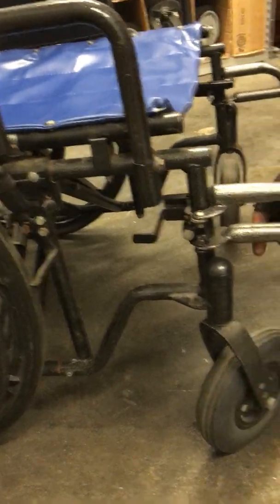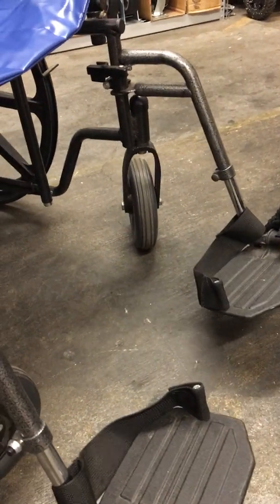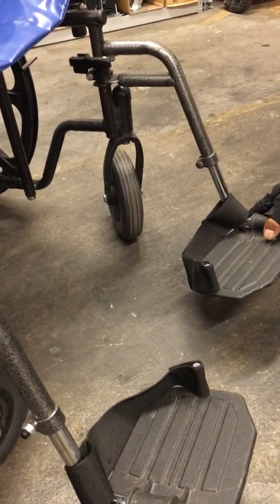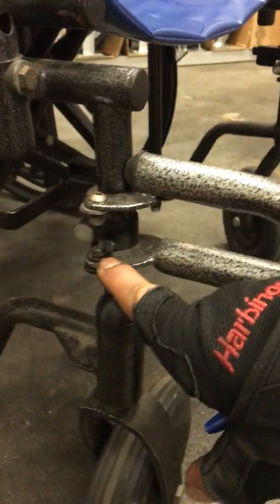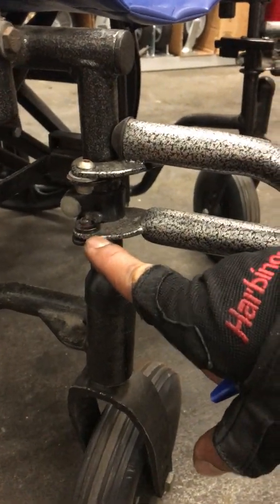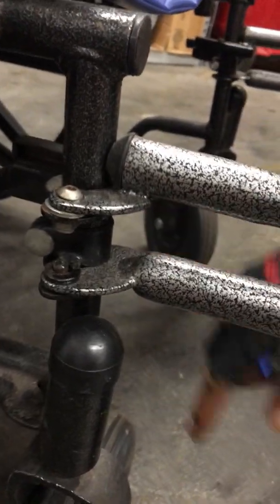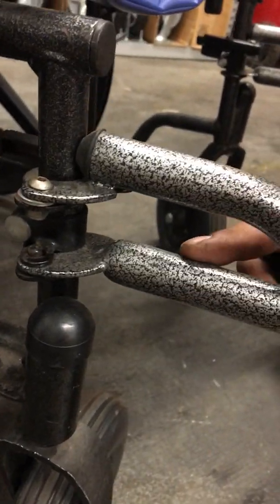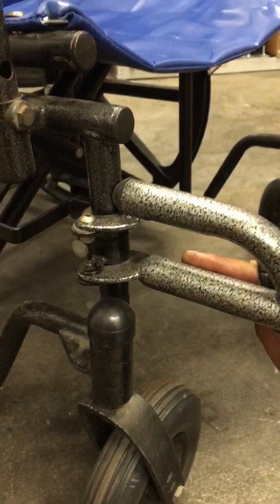Next, the footrests. The footrest would take about 20 to 40 minutes on changing these, and a lot of times would be rusty again, and sometimes this knob right here, if the rust is too bad, there are times it might fall off as well. So the estimated time to fix all of this would be approximately 20 to 40 minutes.